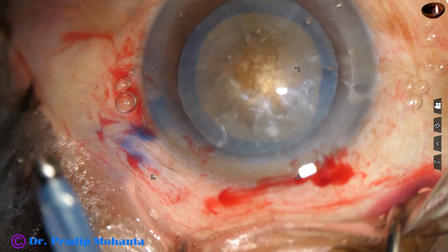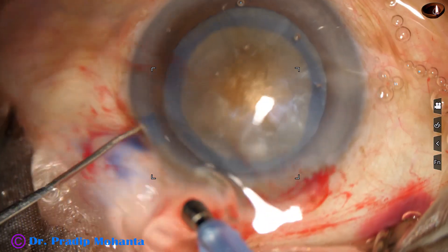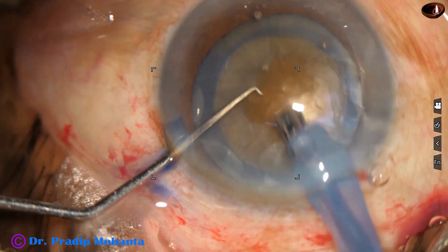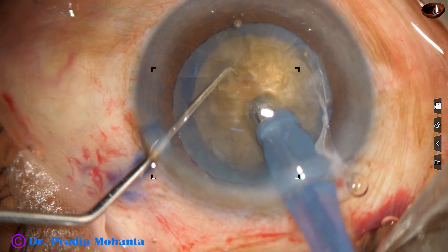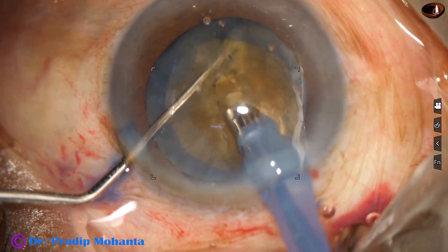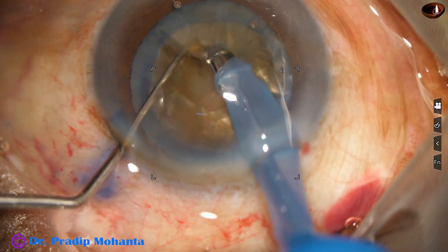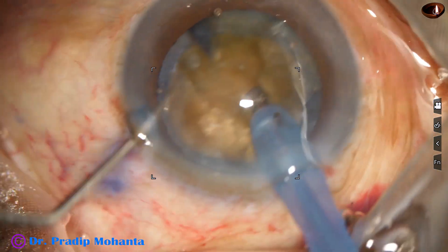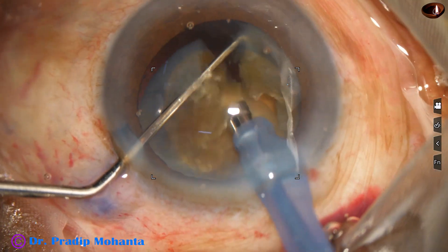The phaco needle goes into the anterior chamber with its bevel down. Some superficial lens matter is removed. I have exposed the phaco needle a little more to manage this hard nucleus. Now I bury the tip into the substance of the nucleus, go towards the opposite equator and get a nice crack. Though the phaco needle was in the substance, you can see that still the track is not deep. And here we can see this endonucleus.